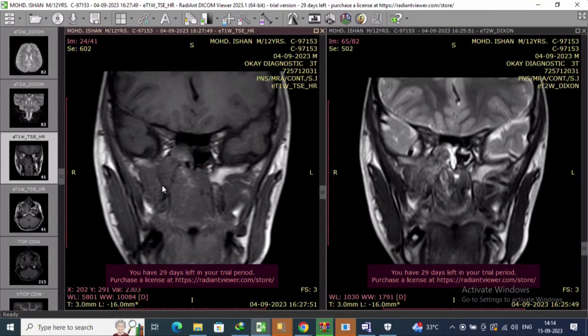Okay, sir. So these are the special sequences by means of which MRI is so versatile. If somebody asks me why MRI is done for this region: to get diffusion weighted to rule out malignancy, to get these sequences to rule out cancellous bone invasion, which cannot be picked up by a CT scan. So this is such vital information, and you have to pick this yourself rather than relying on radiologists to give you all this information.